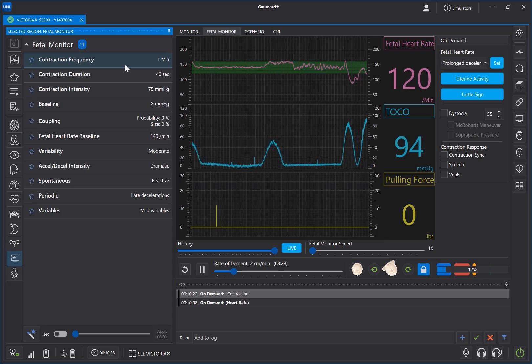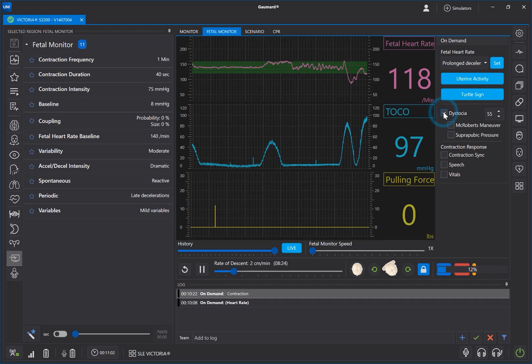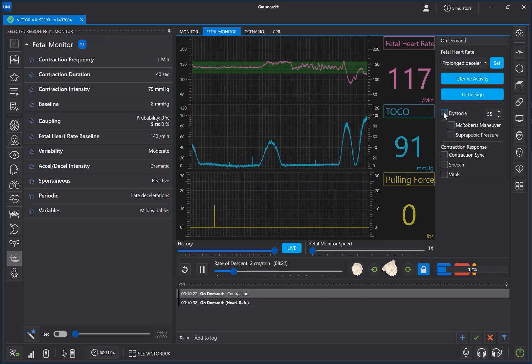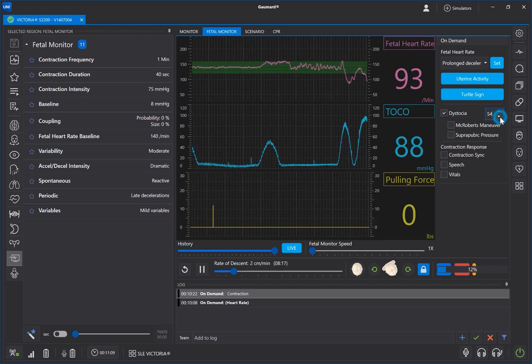You can add shoulder dystocia to your delivery by clicking the box next to Dystocia. Moving the numbers up or down can adjust the point in labor at which the dystocia occurs.